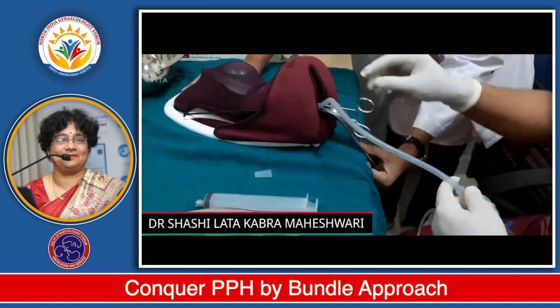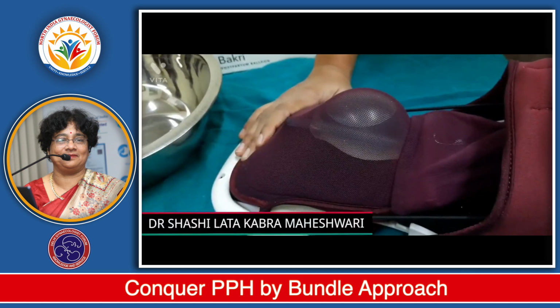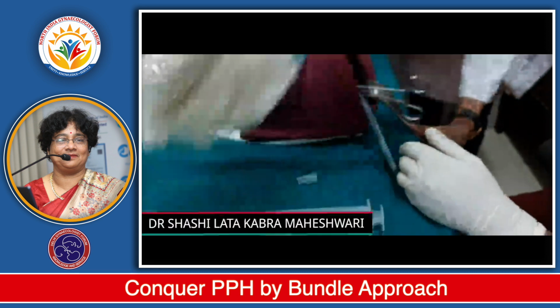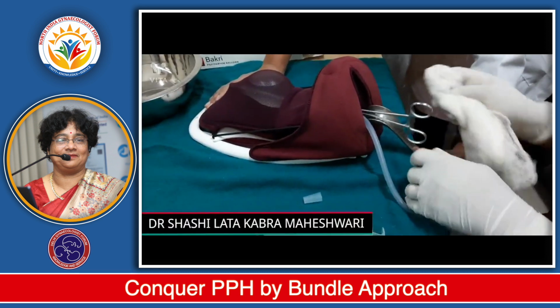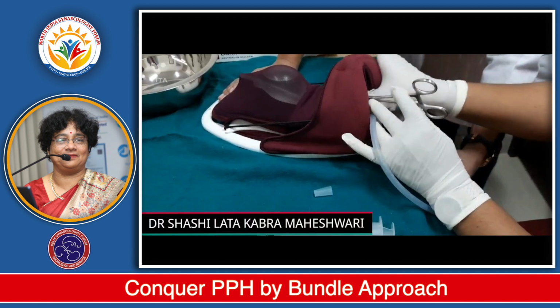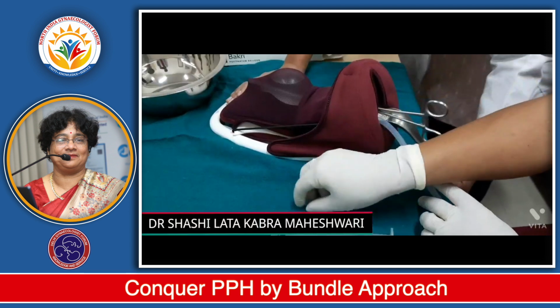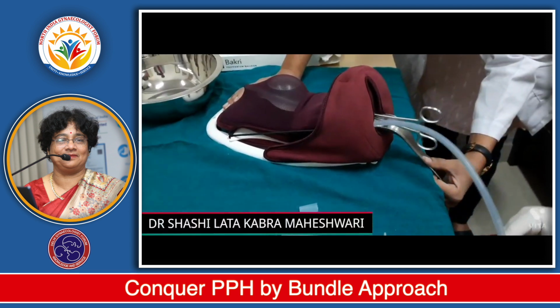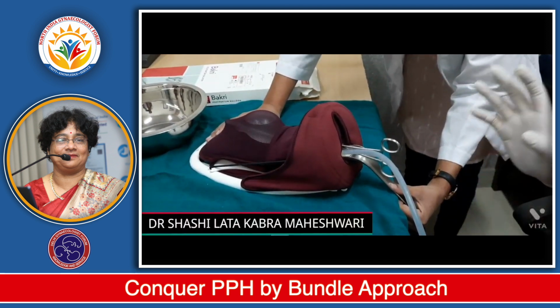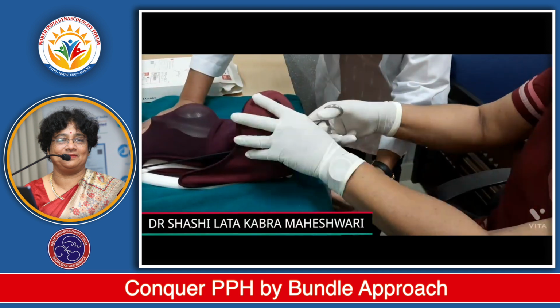And next we will just give a pull like this, and we will attach it to the thigh of the patient. And to keep the balloon in place, we will just do a vaginal packing, which is very important. So it prevents the balloon from slippage. And we have to measure the pulse, BP and vitals of the patient. And if the patient is stable and the bleeding is reduced, then this balloon tamponade is successful and we can continue with it. Now, after packing, we will remove our instruments.